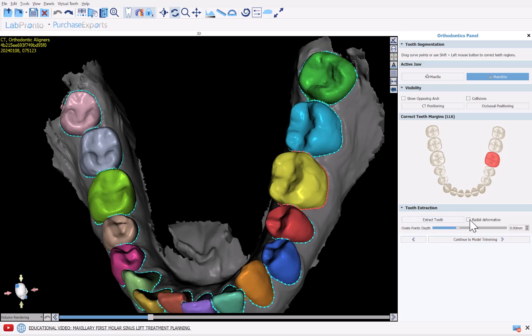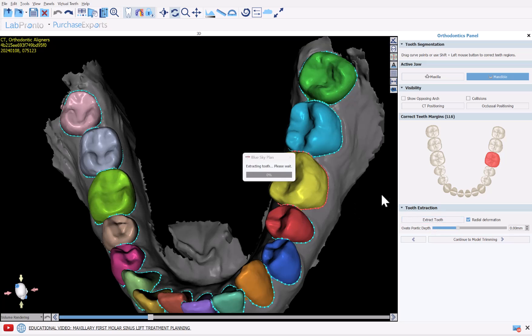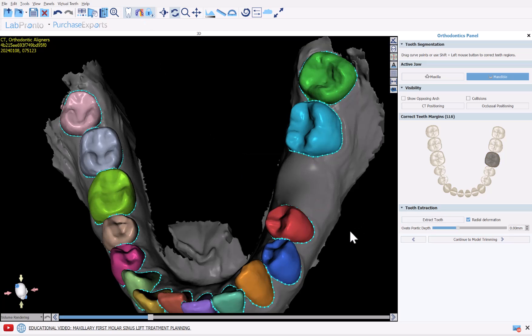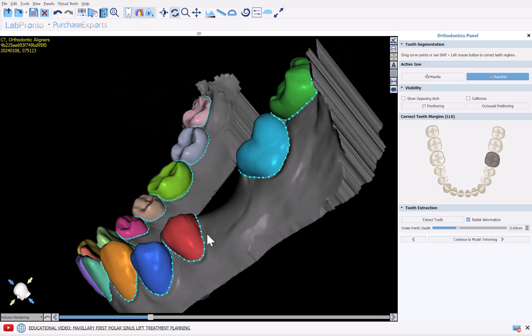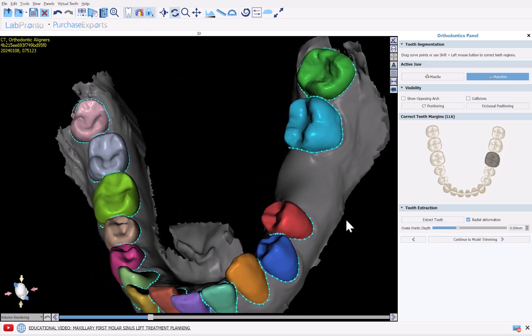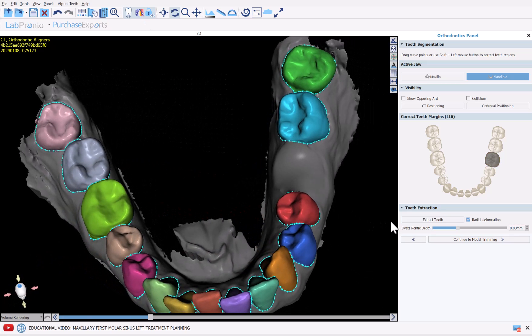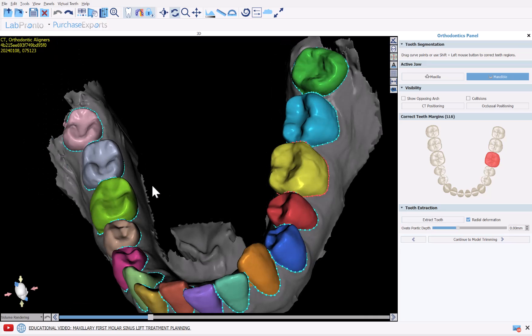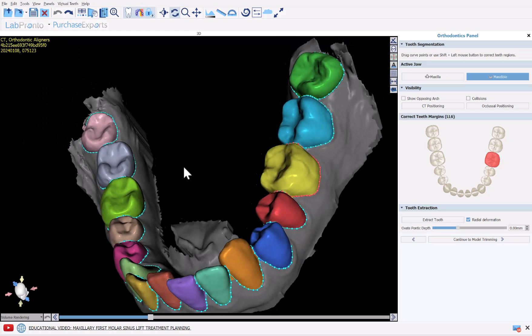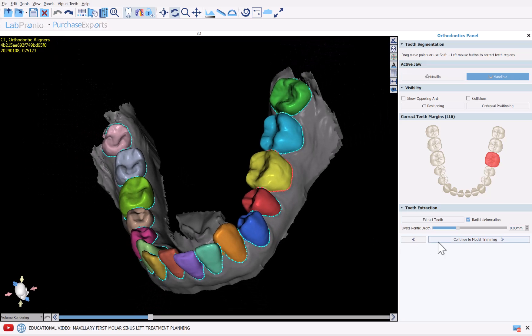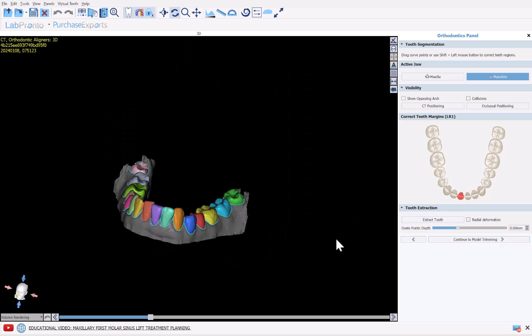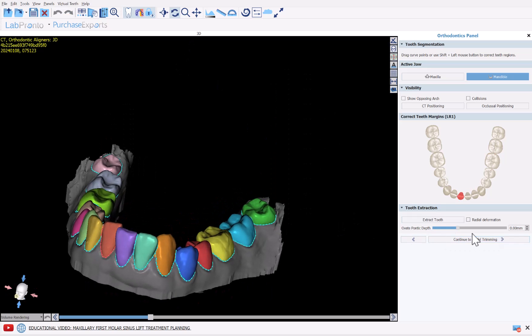We also have an option for radial deformation. You could use the slider to select the relevant depth that you like and once again once the tooth is active, simply click Extract Tooth. OK, we could see the tooth has been extracted and removed accordingly. I'm going to undo that option and we are now ready to proceed with model cleanup. OK, so now I'm going to click Continue to Model Trimming.